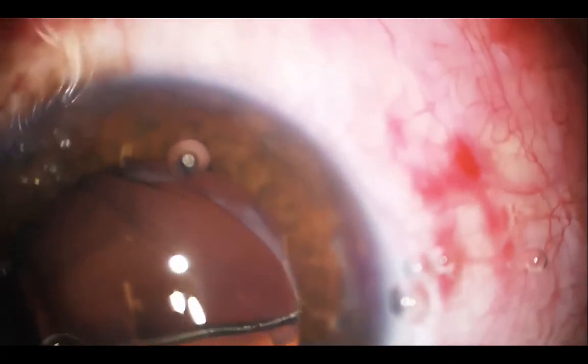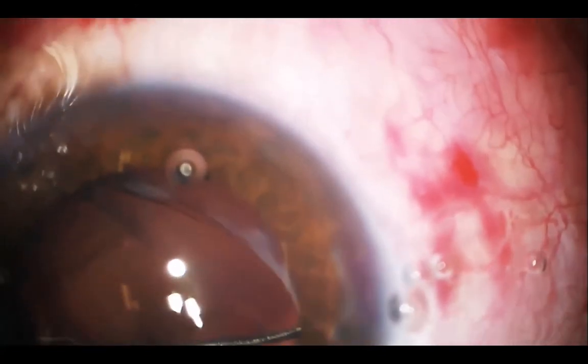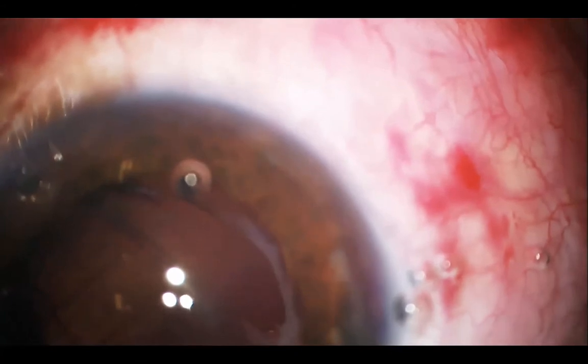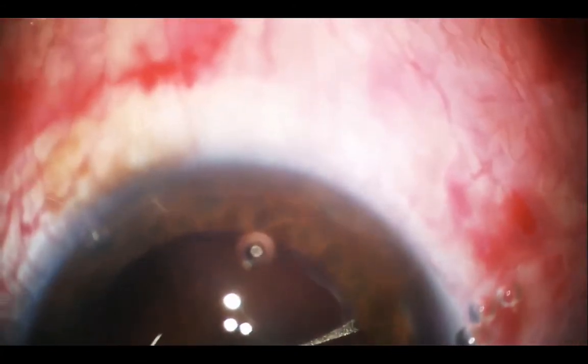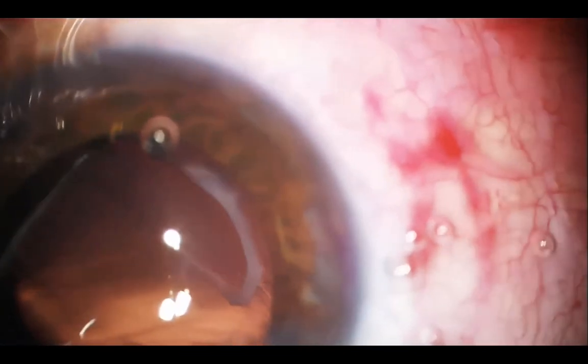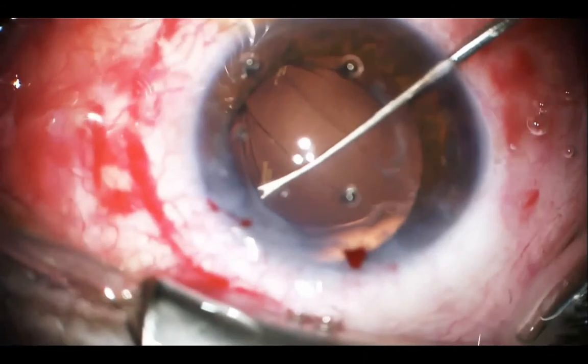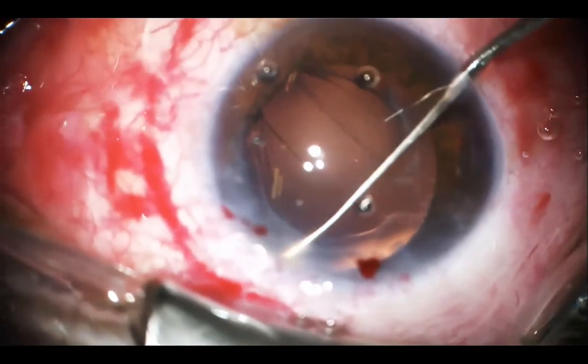And surprisingly, after 6 months of the primary surgery, I could dissect and open the capsular fornices on either side. So now I have capsular pockets ready for implantation of a single piece lens inside these pockets.